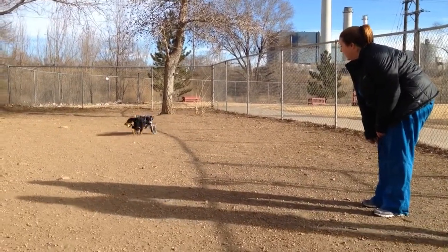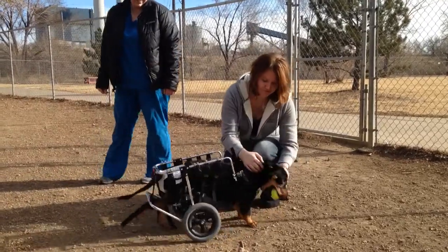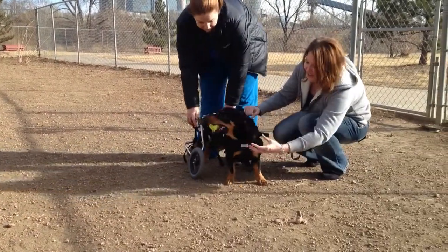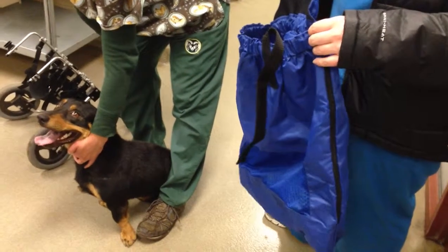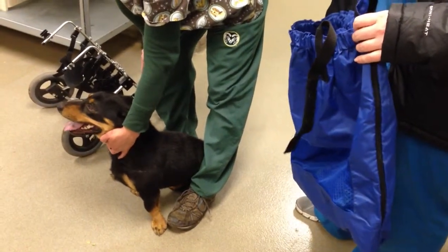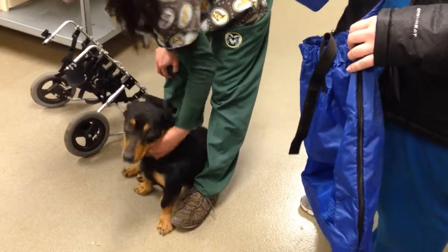He just gets that thing going. He sits in that bag and that protects his feet, because otherwise he could get sores on his legs from dragging them on carpets, over rocks, or anything — even though he'd prefer to use the wheelchair outside. But in this bag, if he's at home, he'll be able to lie down and relax when he wants to, instead of always having to be upright in the wheelchair.